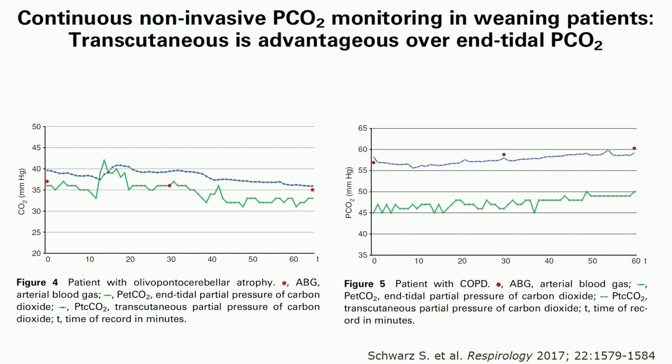a lot. And this is also a patient derived from a scientific trial where we directly compared end-tidal and transcutaneous CO2 monitoring, so both non-invasive techniques for continuous CO2 monitoring in patients with prolonged weaning. And this is a patient with a more restrictive pattern, a more restricted disease. And this is a patient with COPD. In green, end-tidal CO2 values are given, and in blue, you have transcutaneous CO2 values.